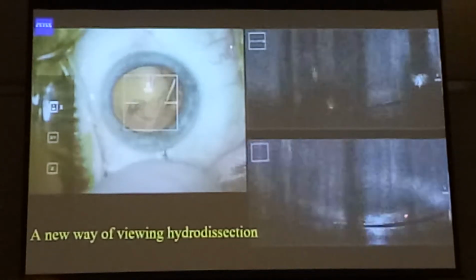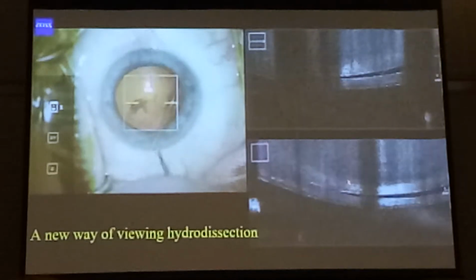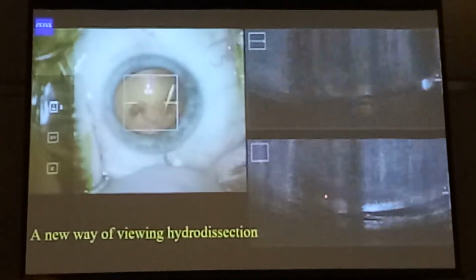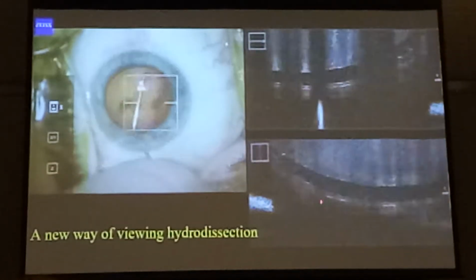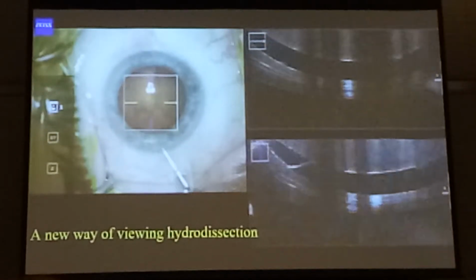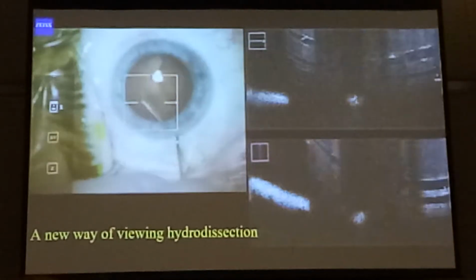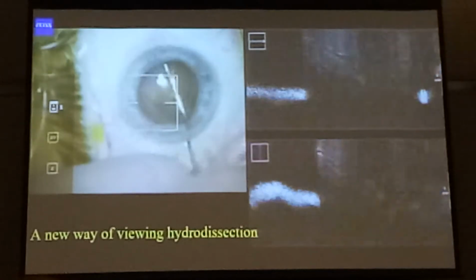See that? There's water coming, and as I inject this, I stopped halfway to show you what happens when you stop halfway, which is what you all do. Then I finish it off. You see how much fluid there is? There's a lot more fluid than you think there is. So I believe that most people have never seen hydrodissection live in 3 dimensions from the side. We all see it from the top.